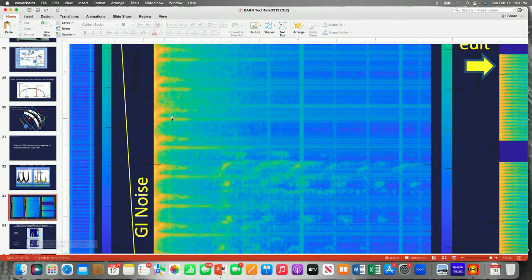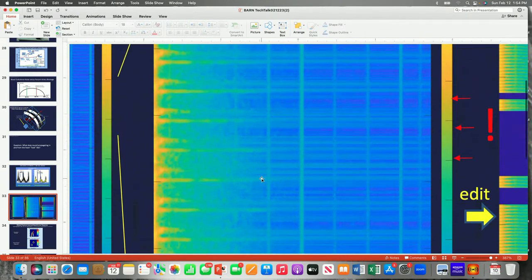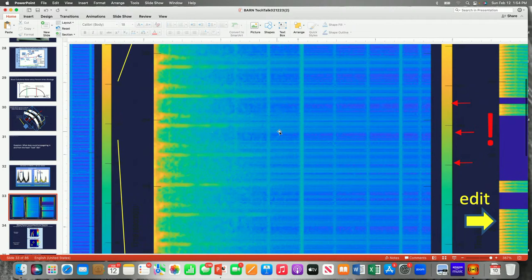And if we look in this interval right here, depending on how much this is filled in, this is where the noise is caused by either a valve or a blockage in diastole. It's one or the other. Otherwise, this is pretty clean. If the blood flow is laminar, you don't see much in here. And you occasionally get a heartbeat that is cleaner than another. It's not bad here, but this stuff here is worrisome.